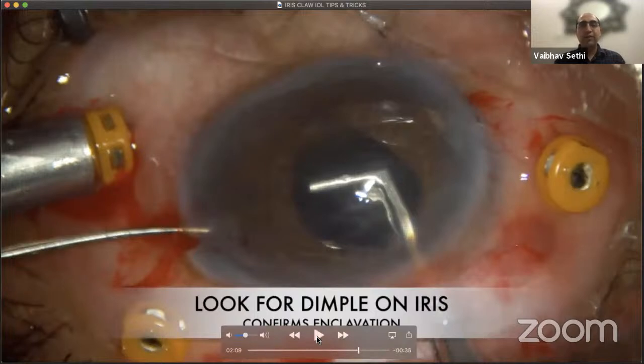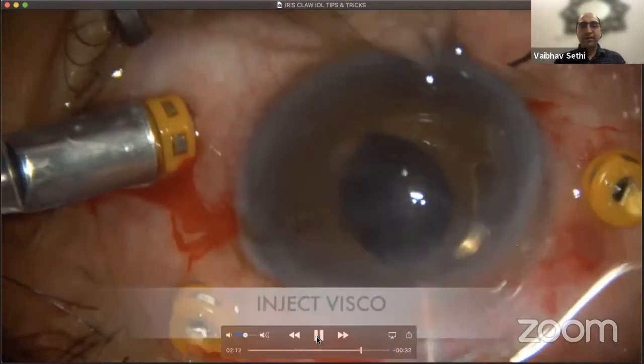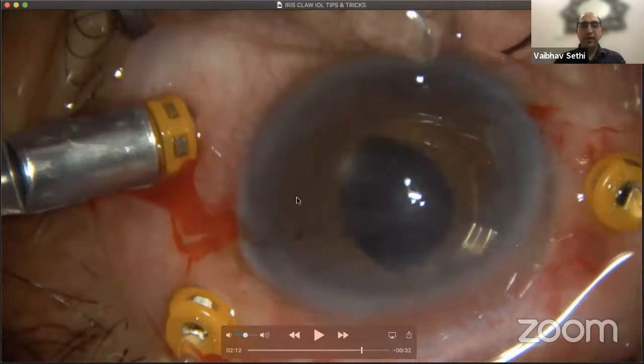What you need to do is feel for the enclavation, and confirm it visually by a dimple. You can either directly press on the iris and put countertraction, but make sure that you don't clip the pupillary margin or near the pupillary margin, because then you'll end up with an eccentric pupil and the patient will have post-operative difficulties. So avoid that. Go to the mid-peripheral iris tissue, and take your spatula or your Sinskey or your 27 gauge needle. After you enclavate one side, as you can see here, there is a dimple I could see. Maybe slightly difficult for you to see, but it's there. And I'm quite sure I've enclavated one end, because I felt it.